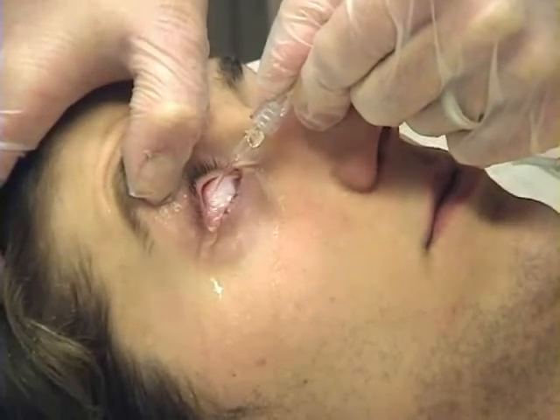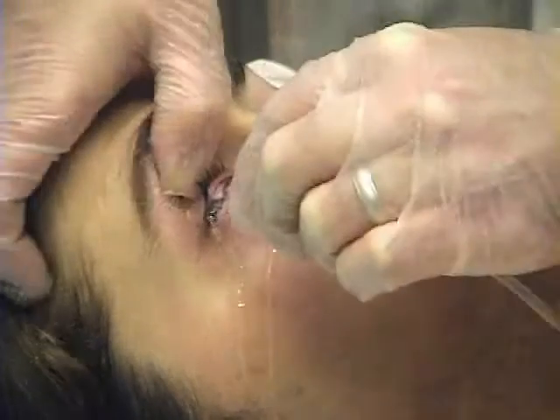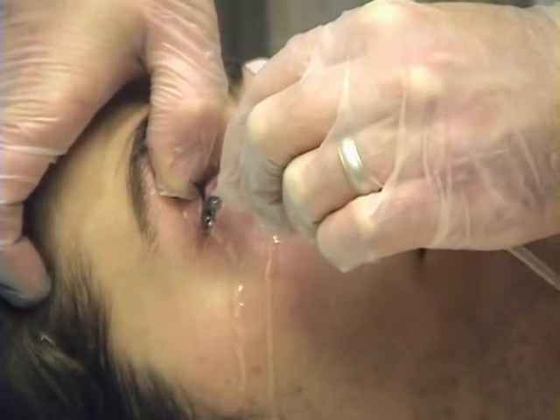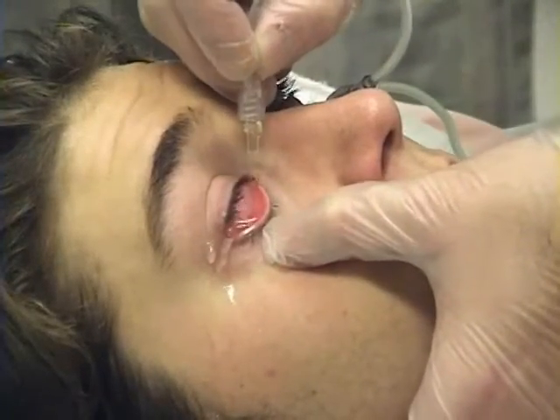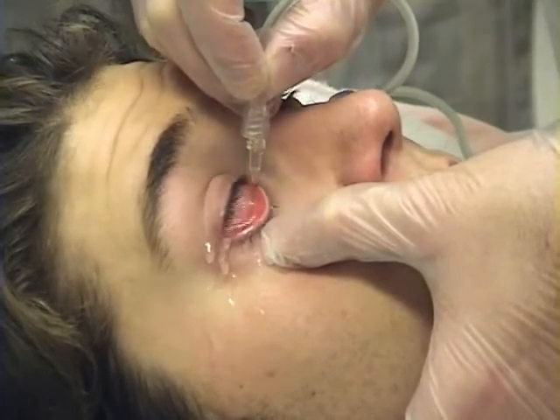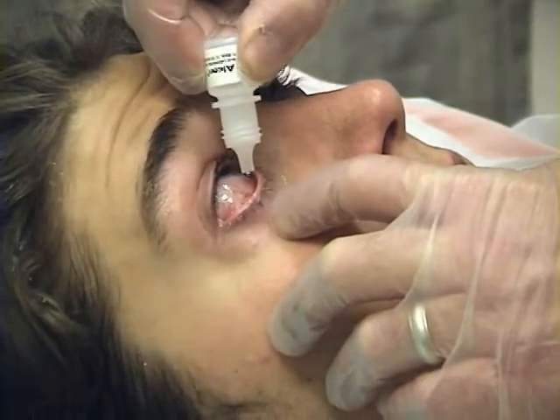The duration of irrigation will vary according to the clinical scenario and must continue until the pH is normalized. In many cases, 15 to 20 minutes of irrigation are required and several liters of saline is used. The patient may require additional topical anesthetic during the irrigation procedure.